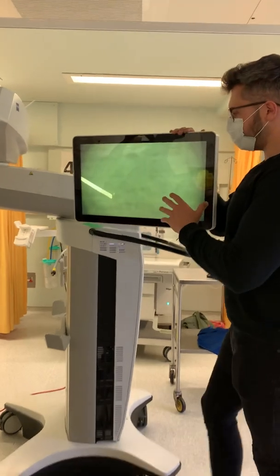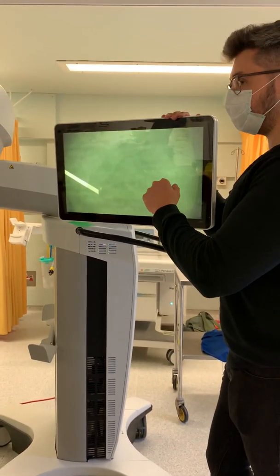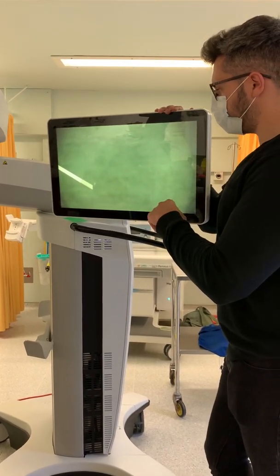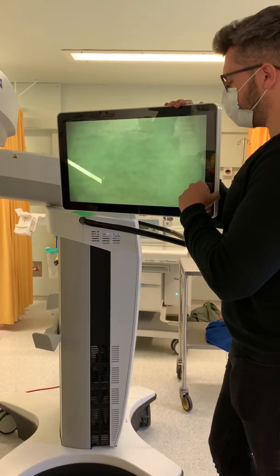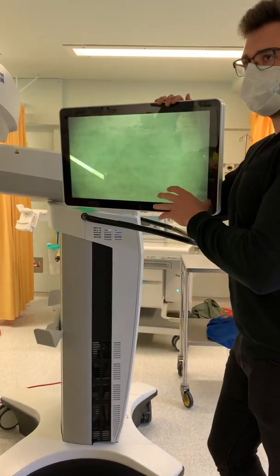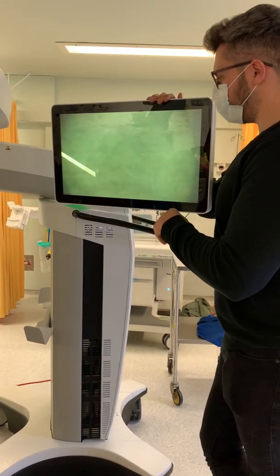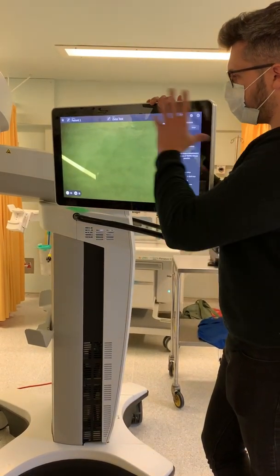On startup you'll be asked to select the user. It's just one user called Zeiss Test at the moment — as we go on we can add more. You'll be greeted with a blank screen which is your video feed. The way to use this is like an iPad — anything you do on an iPad, do here. To bring up the menu, tap anywhere on the screen.